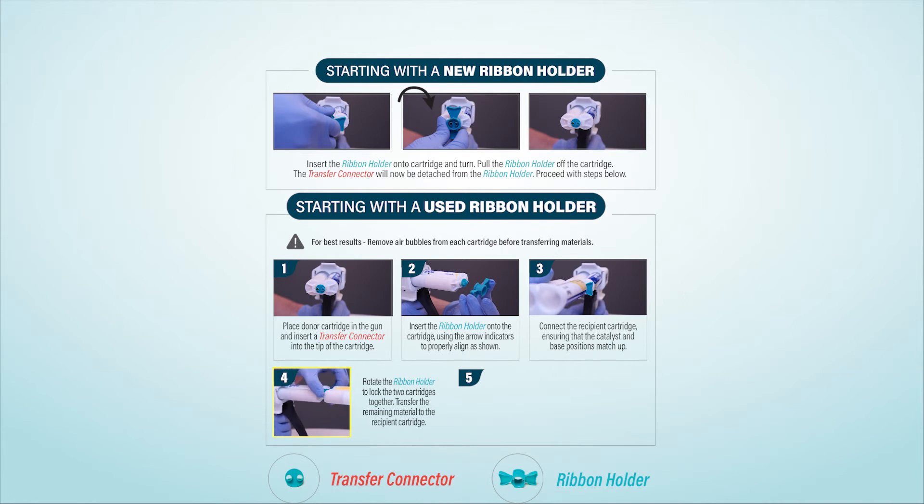Transfer the remaining material to the recipient cartridge. Reverse the rotation of the ribbon holder to unlock the cartridges. Remove the empty cartridge and dispose of it with the transfer connector.